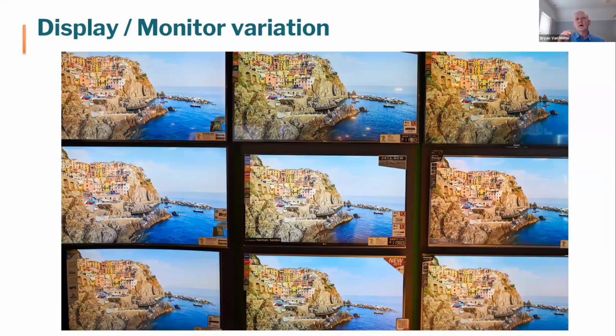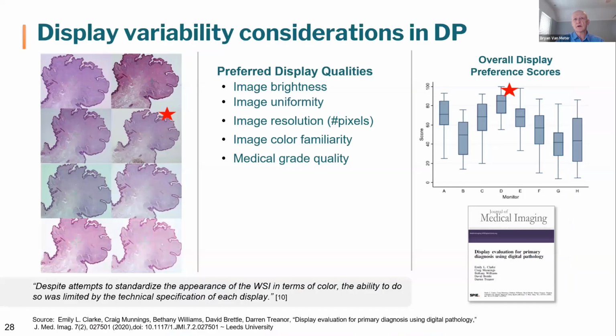When you go to a consumer store and look at the screens and displays and TVs, you see something a lot like this. There are different color profiles, different hues, different brightnesses, different sizes. And the question becomes, which one is correct? In that environment, the one that's correct is really preference. It's preference of what feels better to you, and maybe at that time of day or that day of the week, it feels better to you. But is preference really the right decision for a digital pathology display as a diagnostic tool, as that human interface with the digital image? Especially as digital pathology moves into enterprise imaging, that will come into question with regards to what is the correct image and what is the consistent image that needs to be seen across the enterprise.